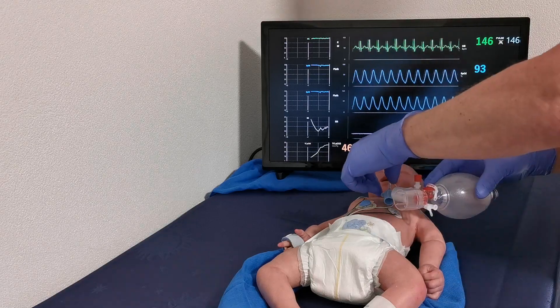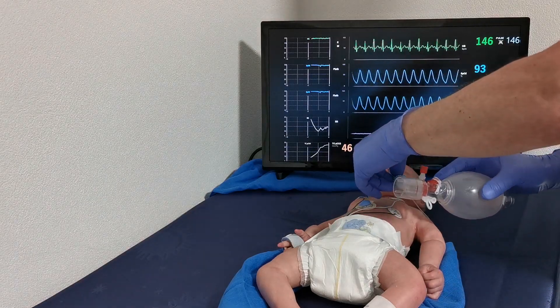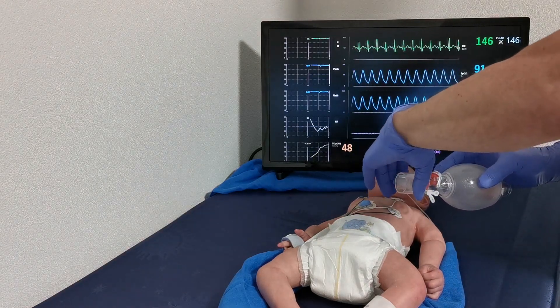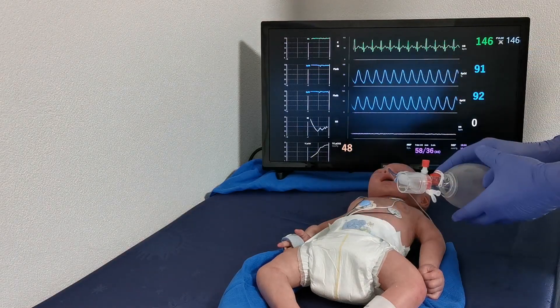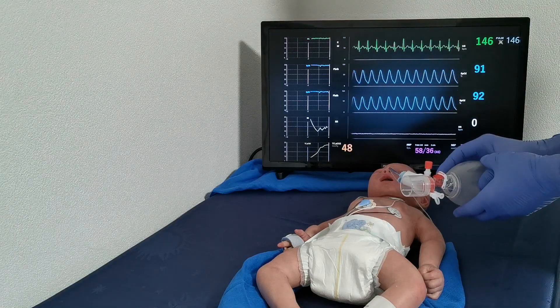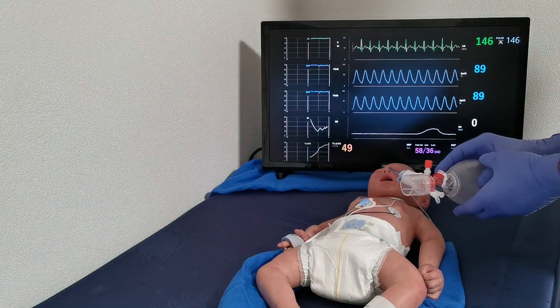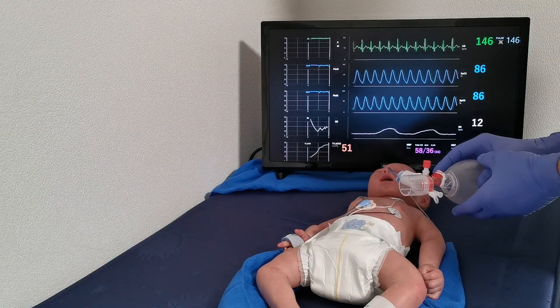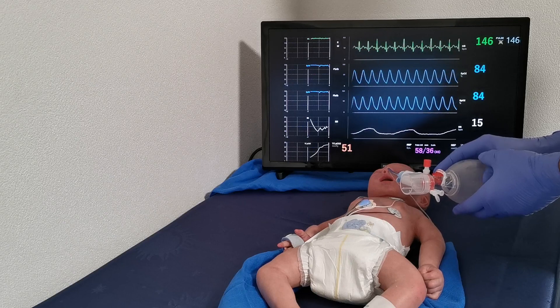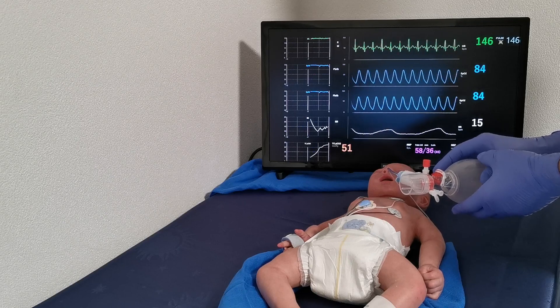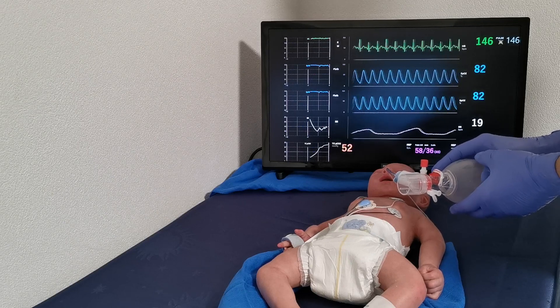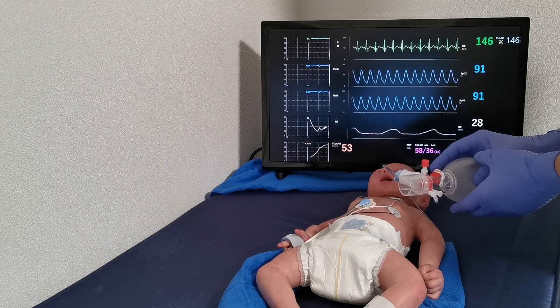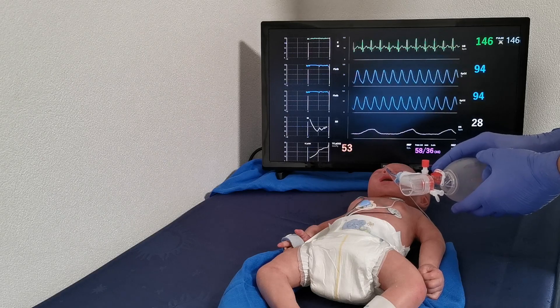If you start ventilation now — bagging, for example — you see the chest rise in the rhythm of your ventilation activity. The restored ventilation is also shown on the impedance curve. After a short time of restored ventilation, saturation rises.